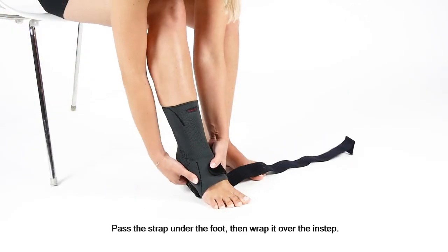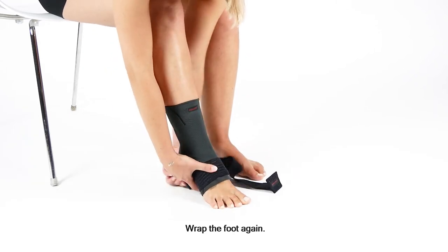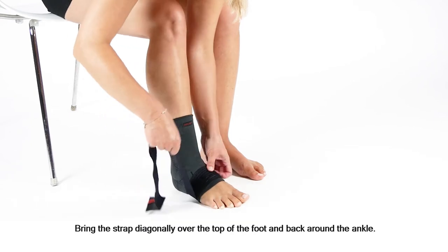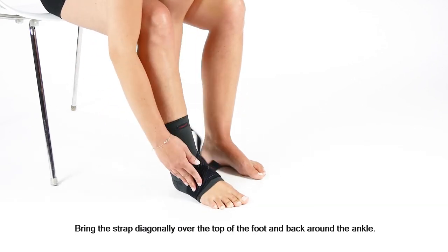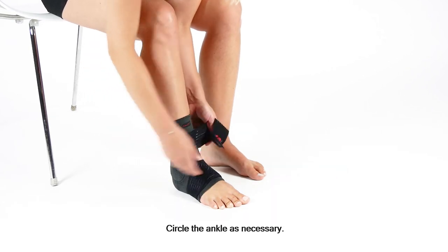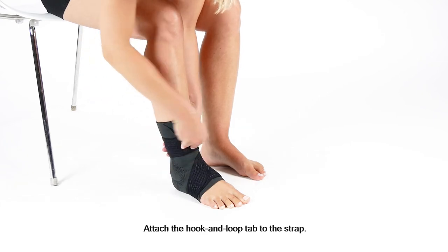Pass the strap under the foot, then wrap it over the instep. Wrap the foot again. Bring the strap diagonally over the top of the foot and back around the ankle. Circle the ankle as necessary, then attach the hook and loop tab to the strap.